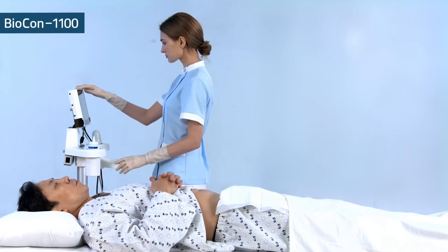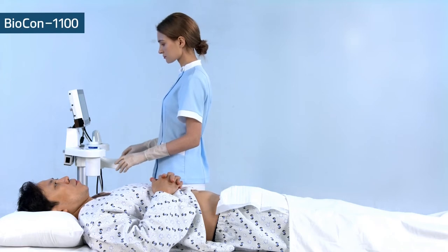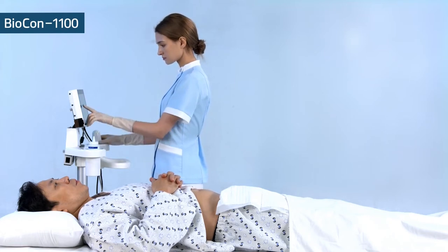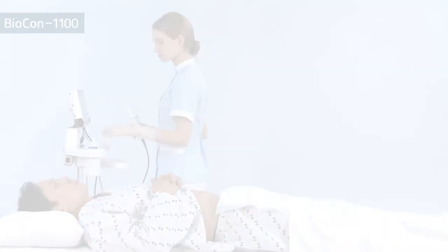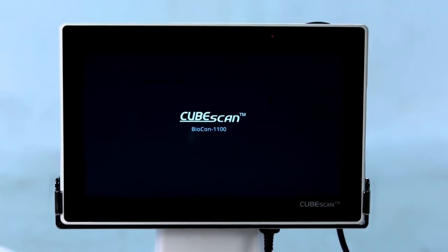Let's take a look at how to use the Biocon 1100. Make sure the patient lies in the supine position. First, press the power button until the screen turns on.